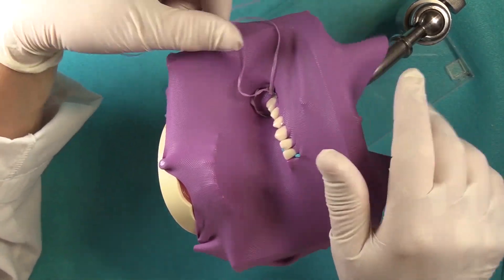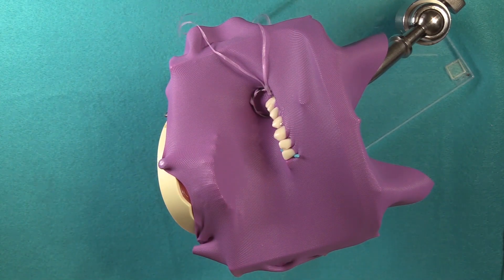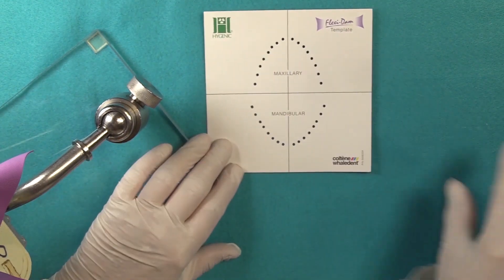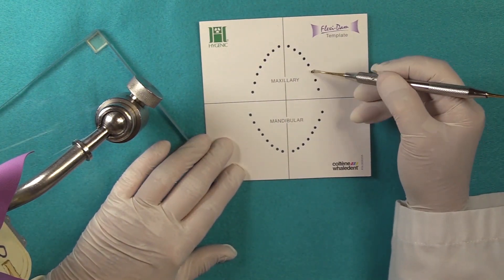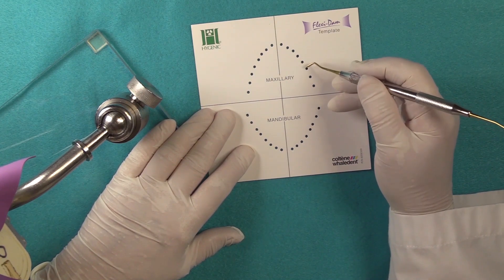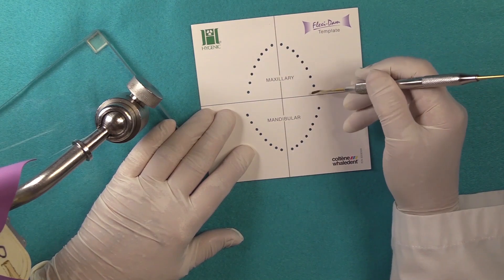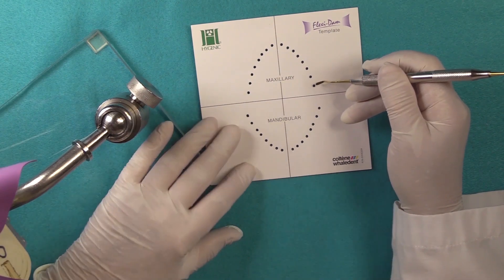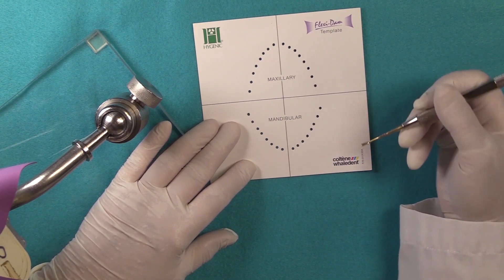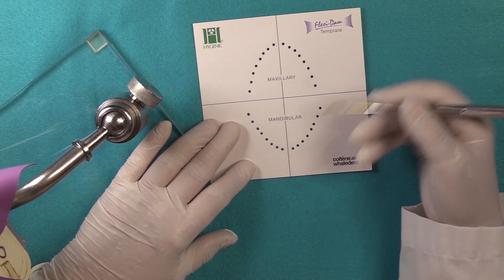The other thing, when we mentioned about punching your holes — there are templates and stamps that are available. The spacing between these holes is meant to be a specific distance because you need enough material to invert and cover the interdental papillae. Otherwise, you're going to have leakage. We also have a stamp that you can stamp the dental dam, but make sure you use a permanent ink and not a water-soluble ink, otherwise there'll be ink all over the place.